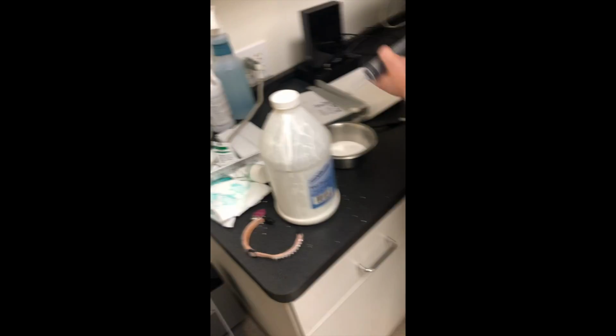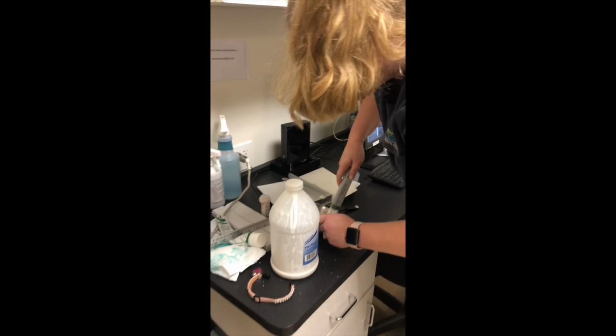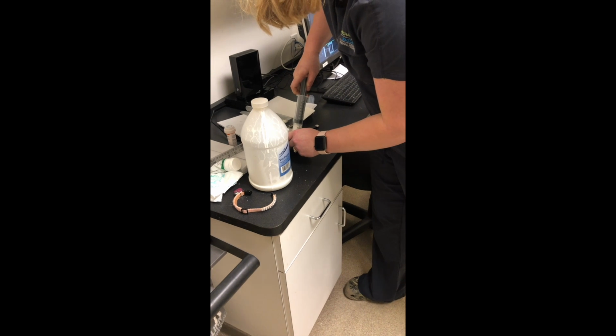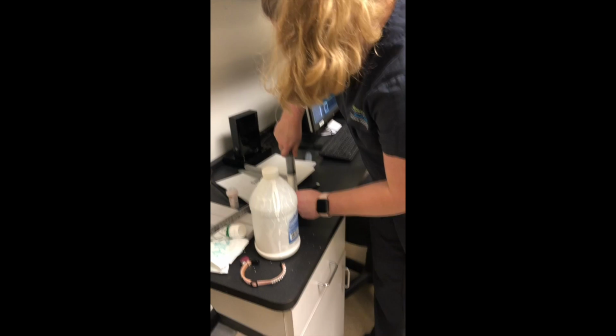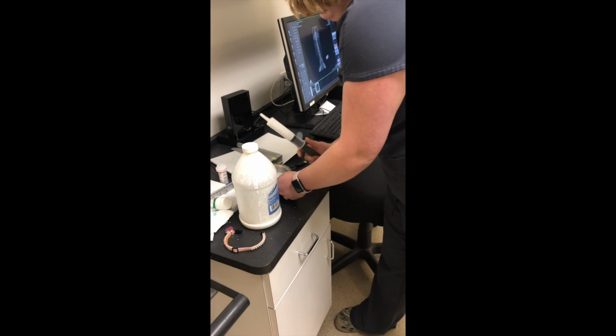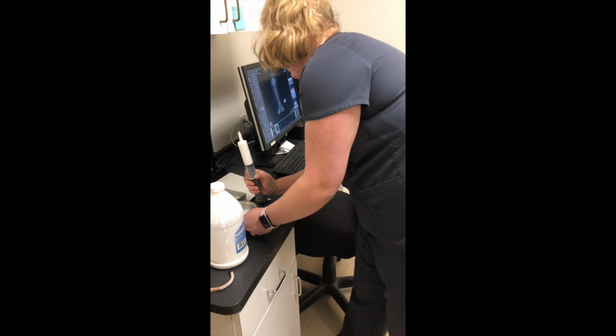Since we are using barium, we will be administering orally. The dose for barium for dogs is 8 to 12 ml per kg for under 20 kg and 5 to 7 ml per kg for over 20 kg. Cat dosing for barium is 12 to 20 mls per kg. We used 12 mls per kg.